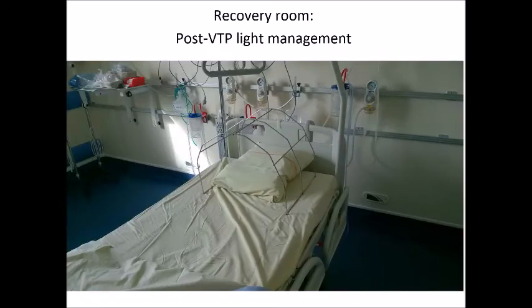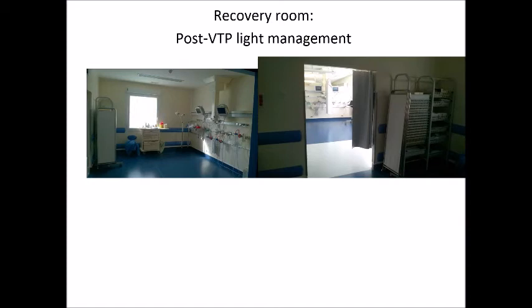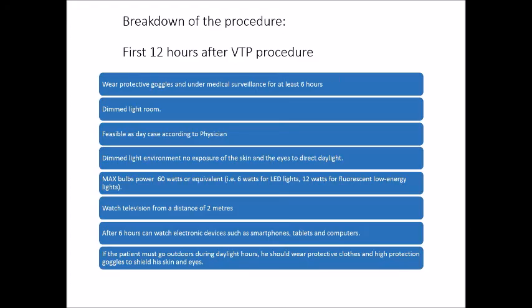Some measures are necessary in the recovery room. The patient stays protected from the light and should not be exposed to sunlight until the following morning. During the 12 following hours, the patient keeps the goggles and stays in the dimmed room.